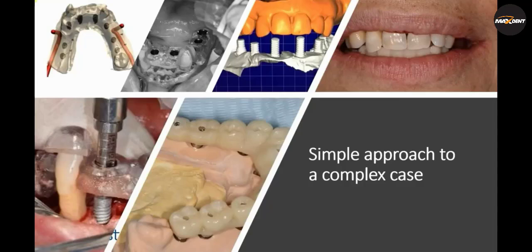Computer-guided prosthetic-driven implant planning resulted in ideal distribution of parallel implants for a screw-retained immediate prosthesis at the level of multi-unit abutments. This was achieved in one sitting with the aid of a stable tooth-supported surgical guide.